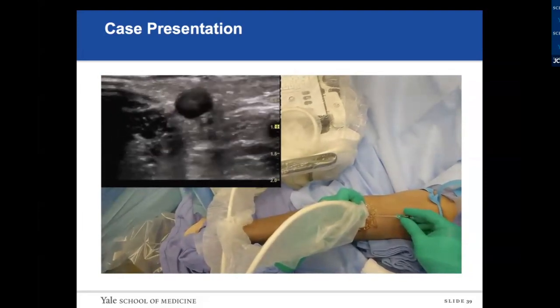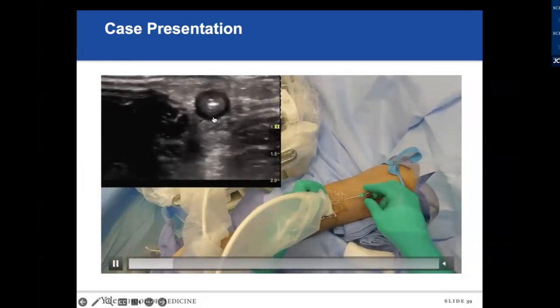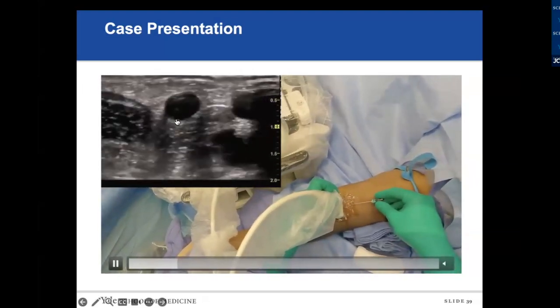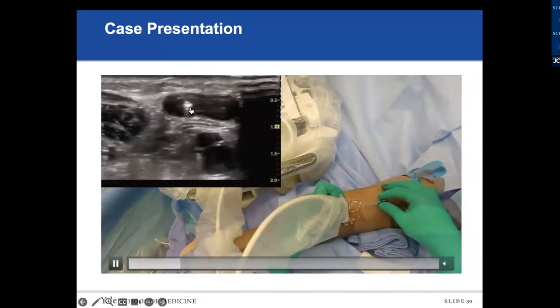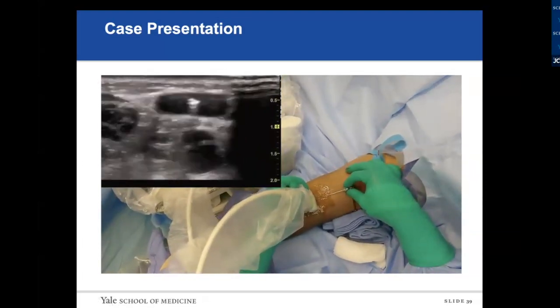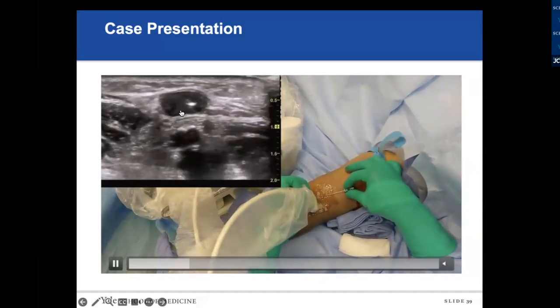And all you have to do is drive your needle down that collateral vein, as you can see here, in the middle of the vessel, and keep advancing that needle all the way down to where you get into the collateral system. So this is getting from the cephalic vein to the collateral vein at the level of the elbow or the antecubital fossa.